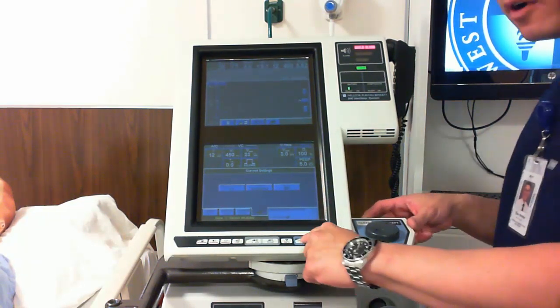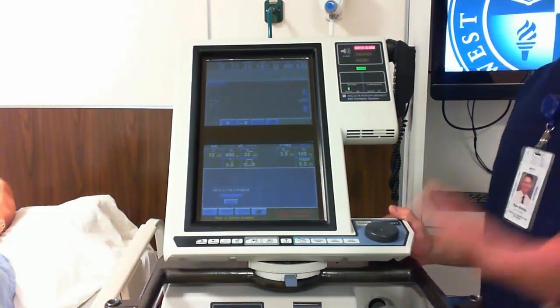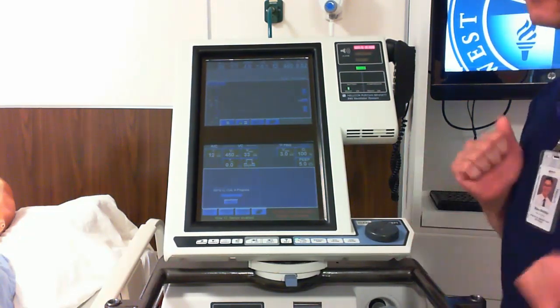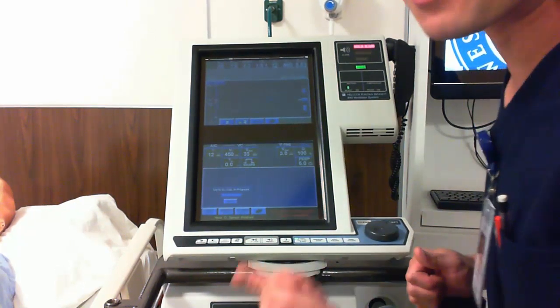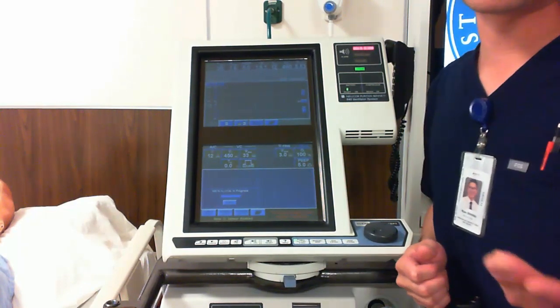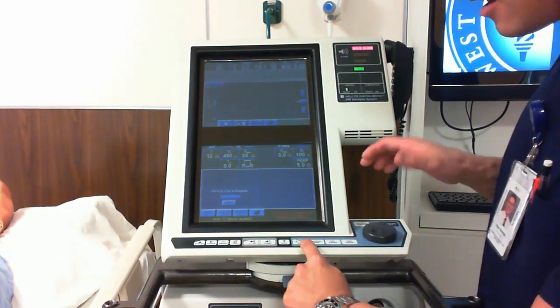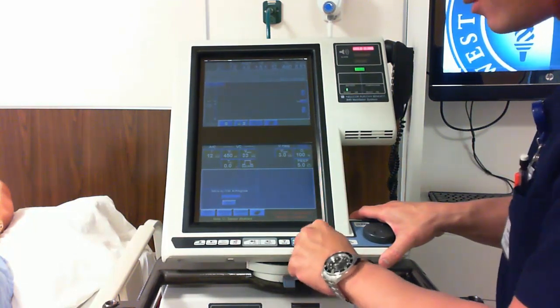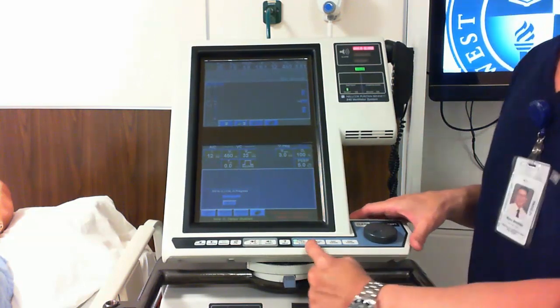So as you guys have probably all read, or maybe a reminder for you, hyperoxygenating our patient. When do we do that? Anyone want to take a guess? Give you a couple seconds. Good guess. So we're going to do it when we're going to suction our patient, or maybe when we're repositioning or turning our patients. So this hyperoxygenate button, which is represented on our ventilator here in the sim lab as 100% O2 for 2 minutes, that's hyperoxygenation.